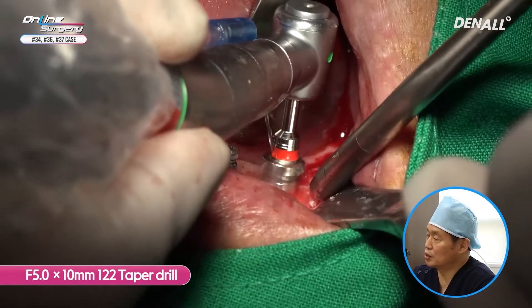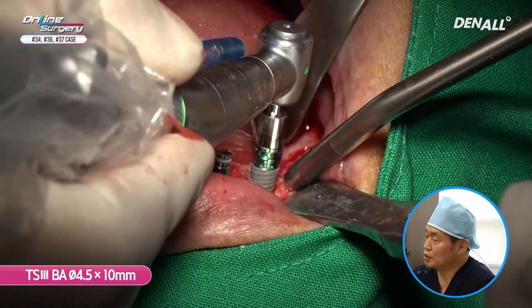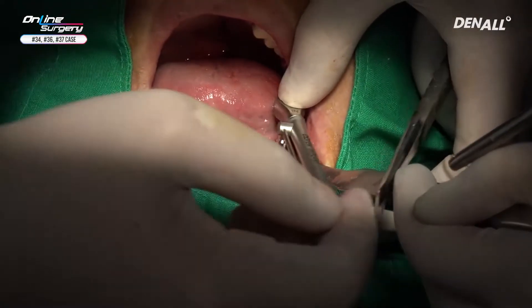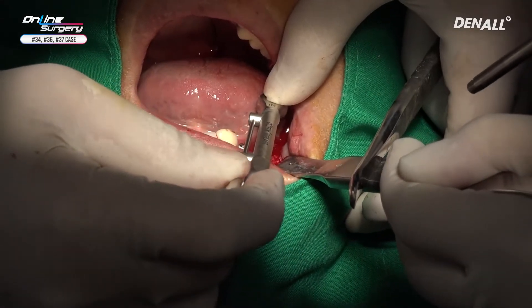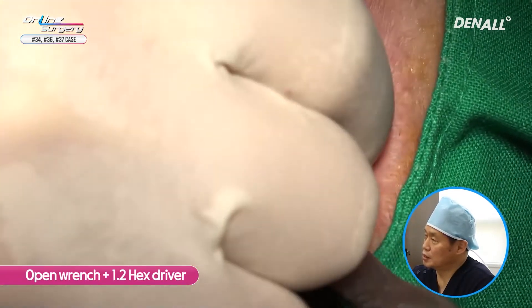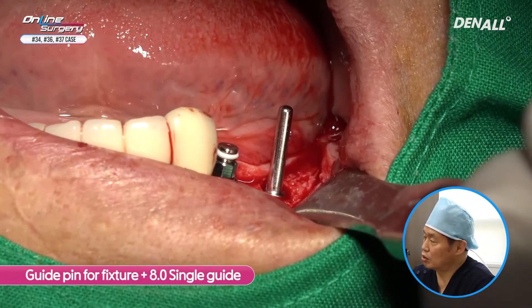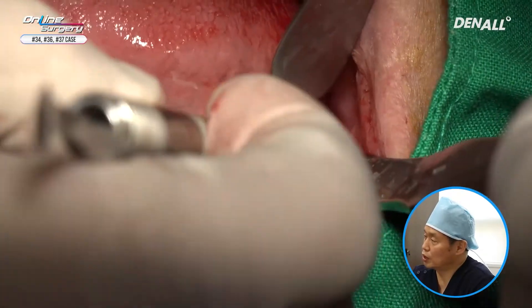The bone was quite hard, so a 5.0 tapered drill was used approximately 50% and a TS3 4.5x10mm implant is placed. To place the implant in number seven, the pre-mount is going to be removed for now. In number 36 in the placed area, a fixture-type guide pin is going to be placed and an 8.0 mm single guide is going to be connected. The posterior position is going to be checked and the 8.0 single guide is going to be used to get the drilling position.